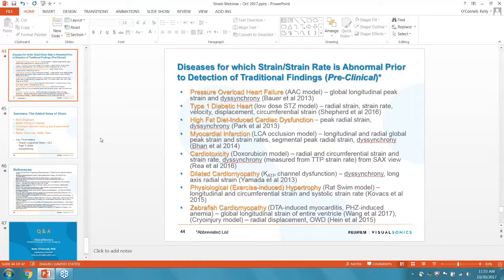Question here about, and I think you touched on it a bit, Kelly, and it's certainly a question that I've had before. I'll give a 15% answer from product management and then pass it over to you. A question about evaluating diastolic dysfunction from the strain analysis. Algorithmically, the way the software works, the diastolic phase and any diastolic dysfunction can be a bit of a noisy measure because of the way that the relaxation state goes on.